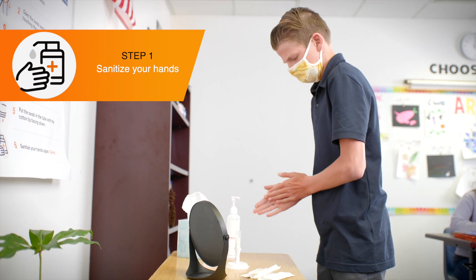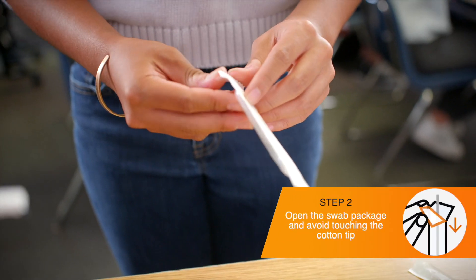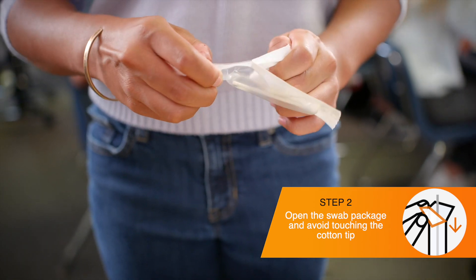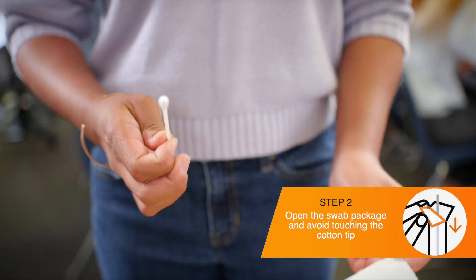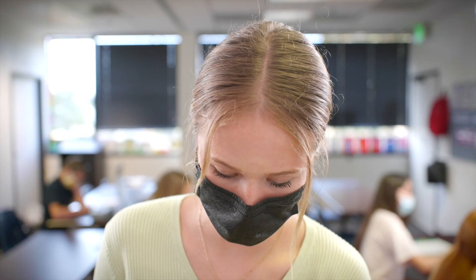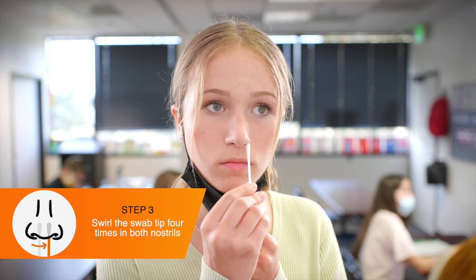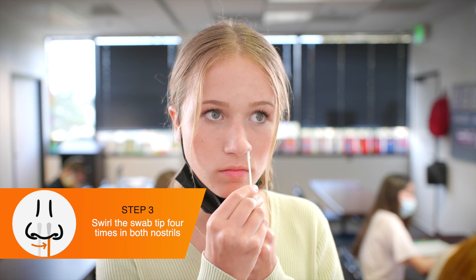Sanitize hands. Pick up one swab. Open up the package handle side first by peeling the two layers apart from each other. Take the swab out, careful not to touch the cotton tip. When ready, participants should lower their face mask below their nose and insert the cotton tip of the swab no more than ¾ of an inch into the nostril.